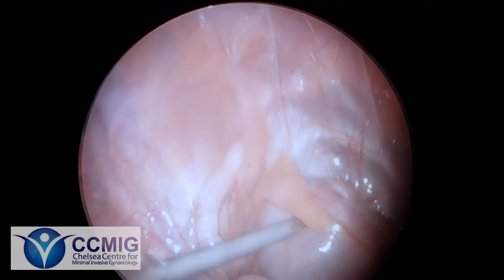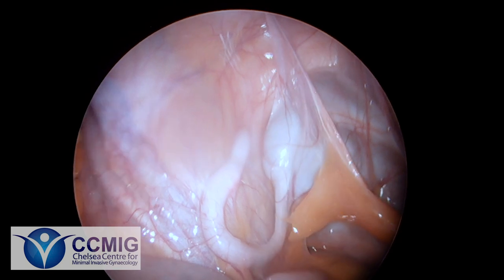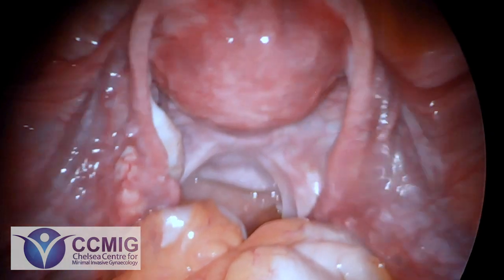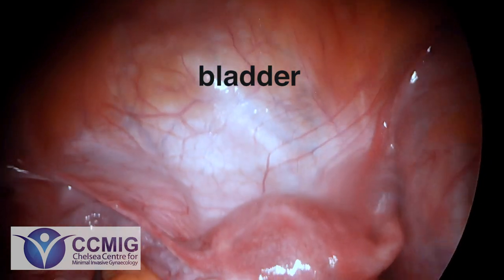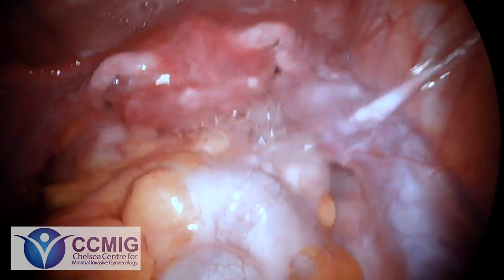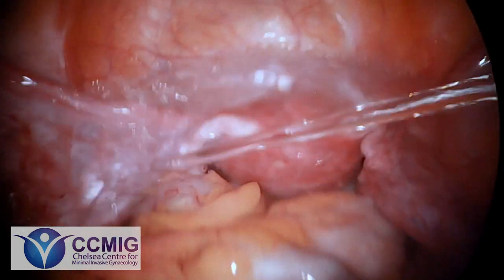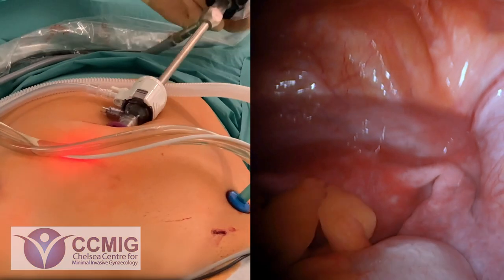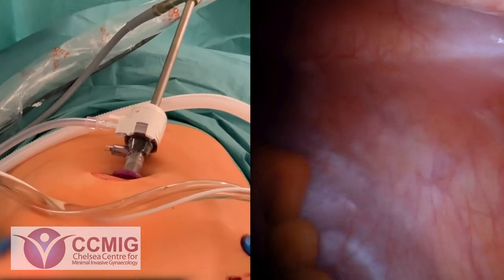As part of any diagnostic laparoscopy it's important to look for any other things that might be causing the patient's symptoms. In this case we always check the appendix, which lives towards the right hand side — you can see it here looking really nice and healthy attached to the large bowel. Going back in with our original scope we get a slightly better view. We can see the bladder in front of the womb — all very happy and healthy with no sign of any endometriosis there. This solution we add to the pelvis reduces the risk of forming scar tissue or adhesions, which can sometimes cause patients pain after surgery even when there isn't any endometriosis. Now we carefully suck out all the gas — you can watch the abdomen going back to a normal shape — and then it's time to take our ports out and close everything up.